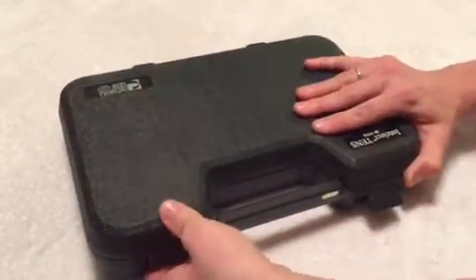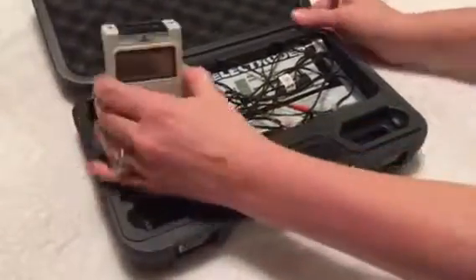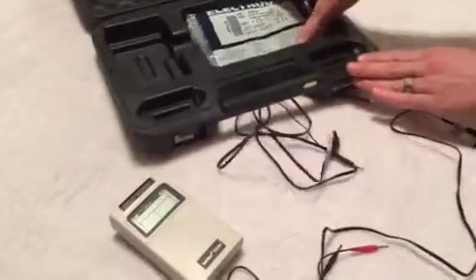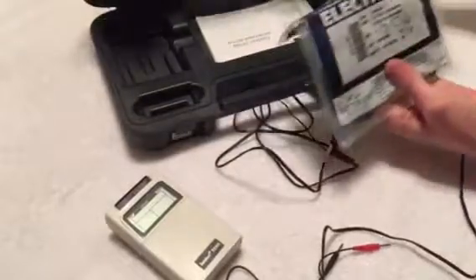You can open up the case and this is what the unit looks like. In each case there'll also be two lead wires that we'll pull out and a packet of electrodes. There will also be a laminated sheet with quick instructions on how to use the TENS unit.